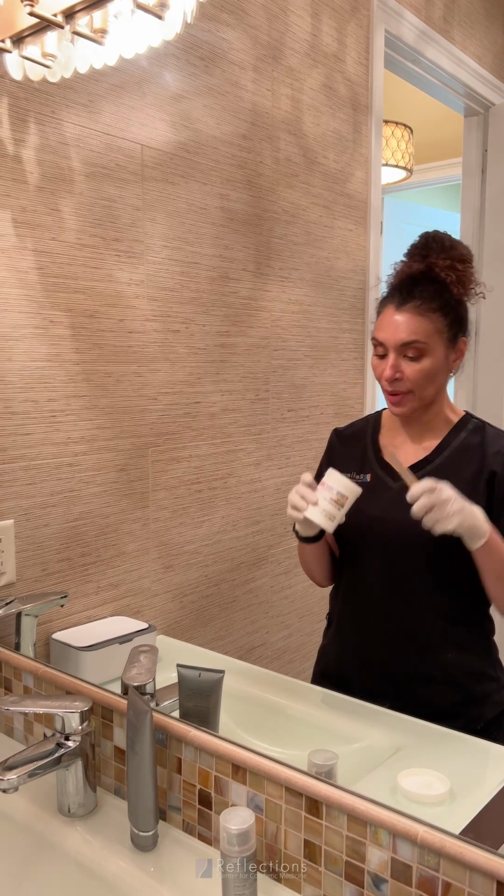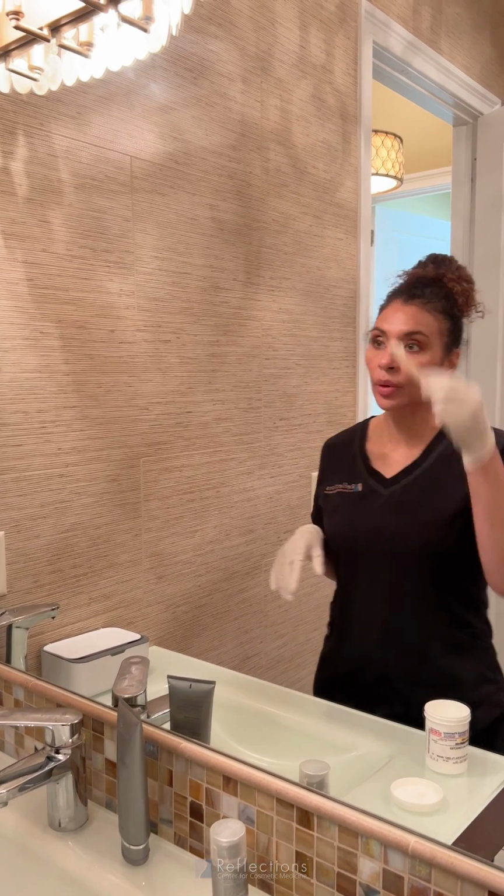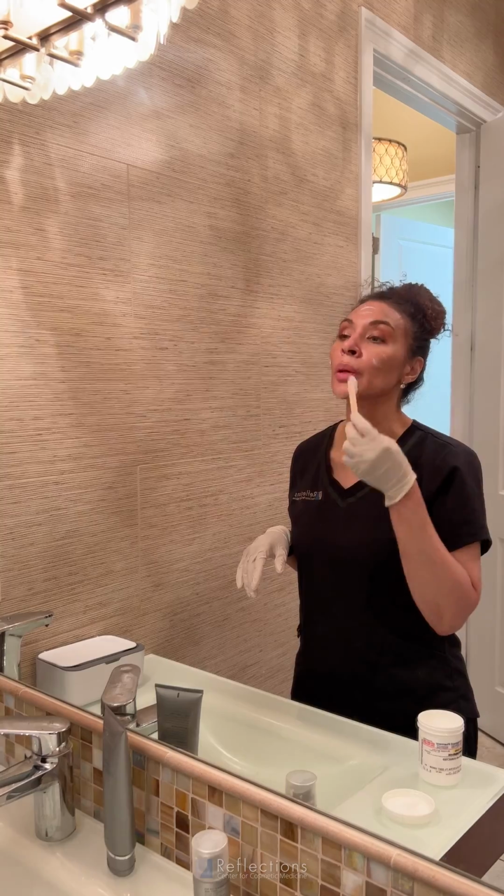First thing we're going to do is, of course, take off the makeup. Next, we're going to use some numbing cream. And I'm going to apply that everywhere I'm going to do the procedure.